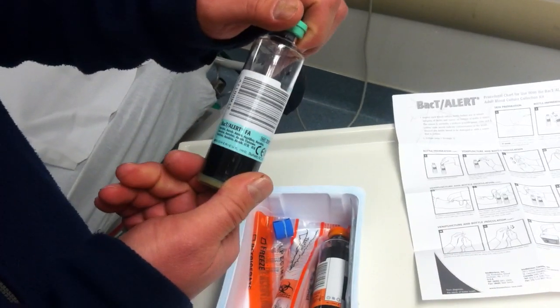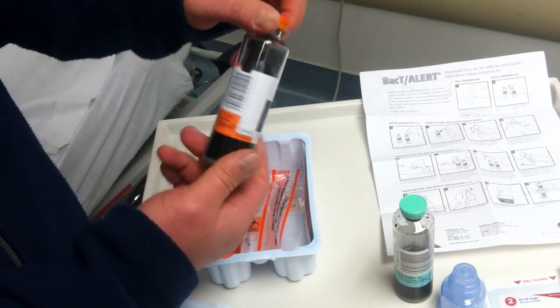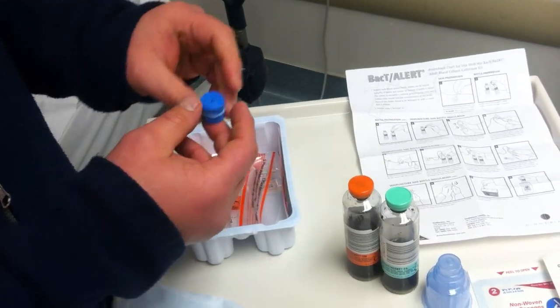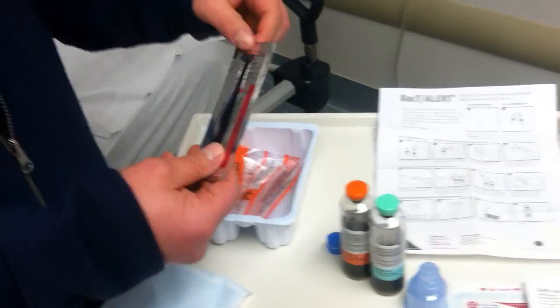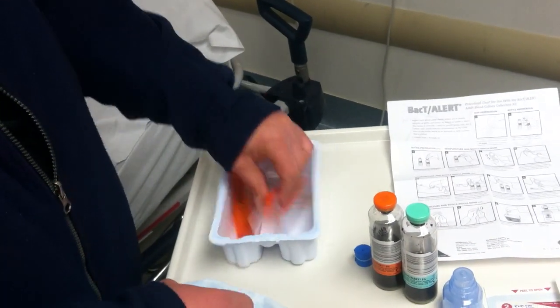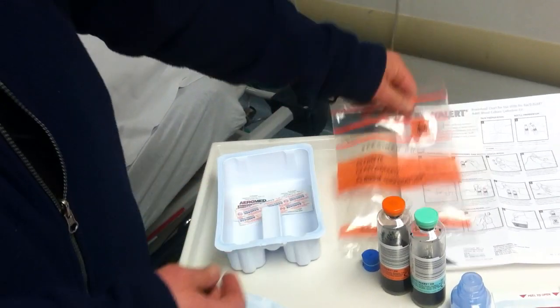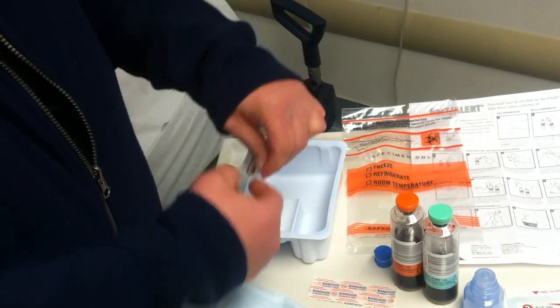One blood culture bottle is for your aerobic bacteria and the other is for your anaerobic bacteria. Also included: a latex-free tourniquet, chlorhexidine chloroprep for prepping the skin, a transfer bag for specimens, a bandage, and alcohol pads.